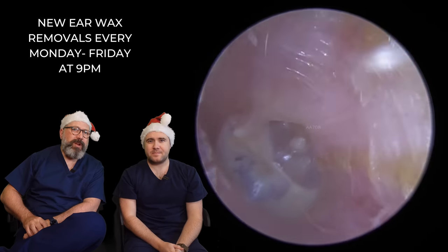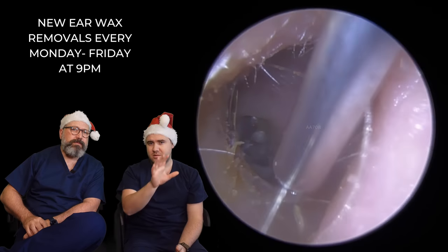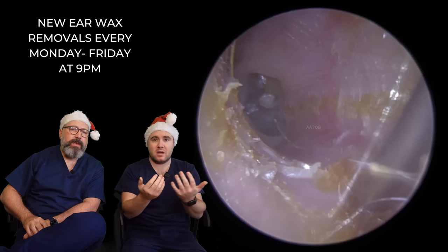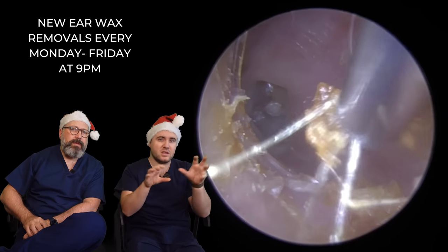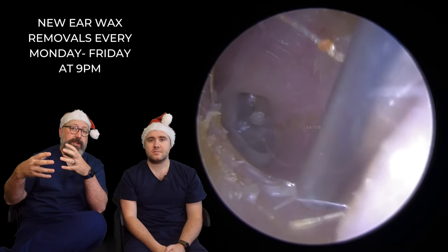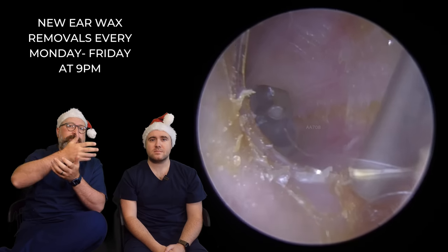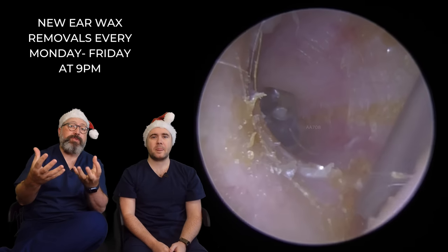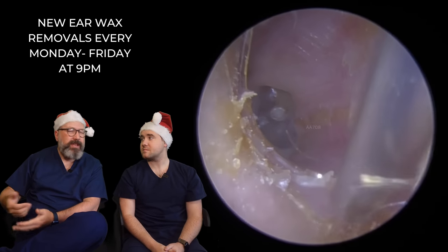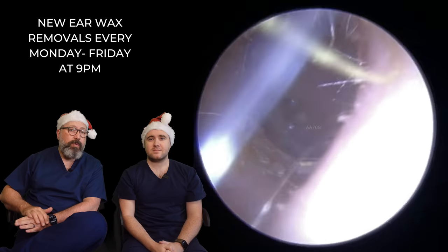That's quite a big retraction pocket on that - it looks like we've got a couple of retraction pockets there. The patient has had hearing issues for quite a while, but not due to these retraction pockets. A retraction pocket is just where little pockets or sections of the eardrum almost suck inward slightly, a bit further than other parts of the eardrum, which is why it looks very bumpy. This is related a lot to middle ear pressure - if you've got reduced middle ear pressure, the pressure behind the eardrum should be the same as the outside ear pressure, which keeps the eardrum sitting nice and central. But if you've got slightly reduced middle ear pressure, and slightly thinner skin on parts of the eardrum, that's going to draw those areas in more effectively, and you end up with these little dents on the eardrum which we call retraction pockets. It doesn't always affect hearing, but if they're quite pronounced and very severely retracted, it can actually affect the ossicles as well - it can degrade and start to weigh down the ossicles behind.